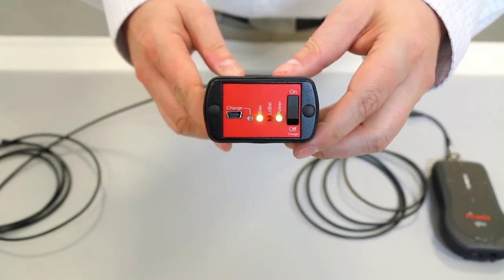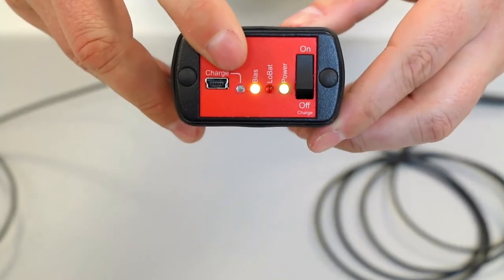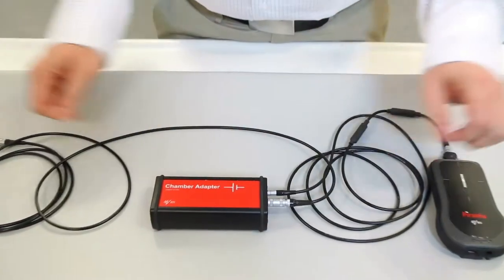Note that the bias voltage will be active as long as the chamber adapter is on. Therefore, it is important to only connect or disconnect ion chambers when the chamber adapter is switched off.